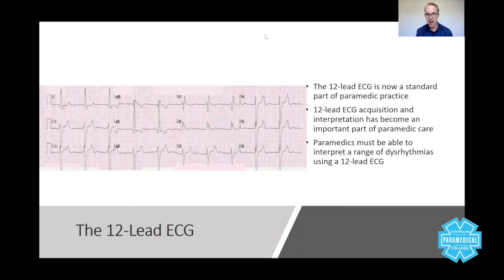Now, when I say the heart, I actually mean the electrical conduction system within the heart and not the heart itself. So actually what you're seeing here is the view of the movement of the electricity through the different regions of the heart. Just in this image here, you have different leads. So these are your 12 leads. Ironically, it's called a 12-lead ECG because you're seeing 12 different views of the heart, but there's actually only 10 dots, 10 electrodes that you place on the chest.